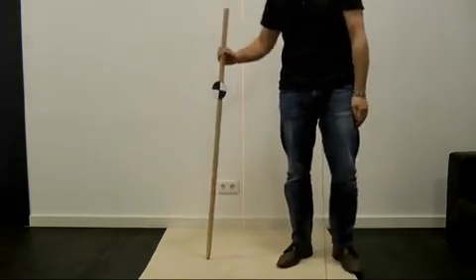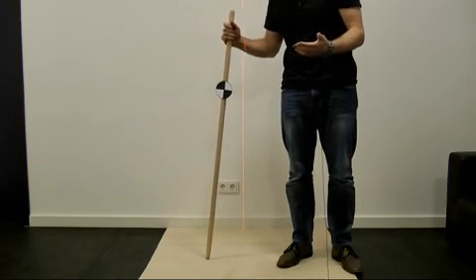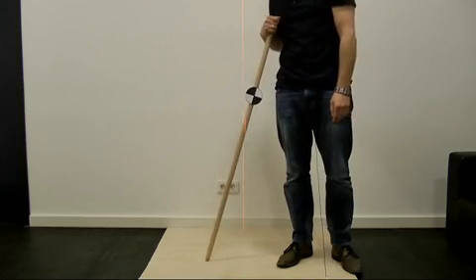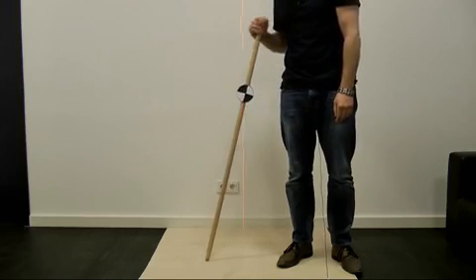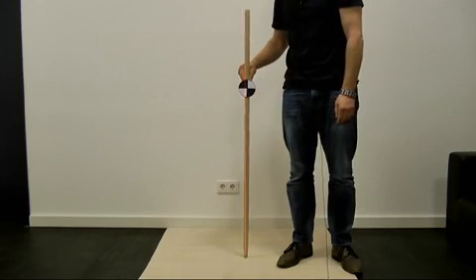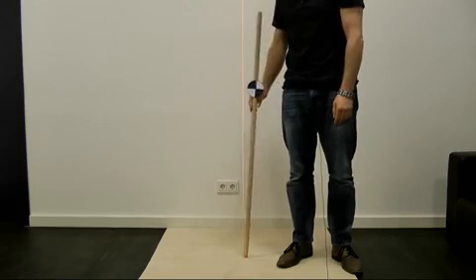You could say that the alignment of the broomstick was far from ideal because it was so slanted. But even if I idealize the alignment and stand it straight as a candle, the broomstick will fail to achieve stability simply because the support surface that is available to it is way too small.